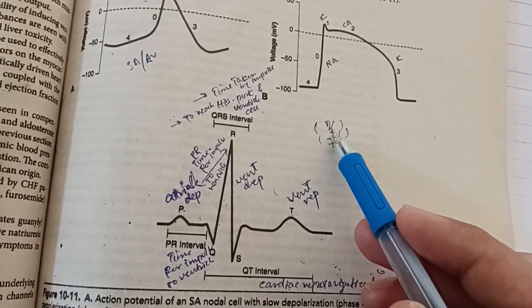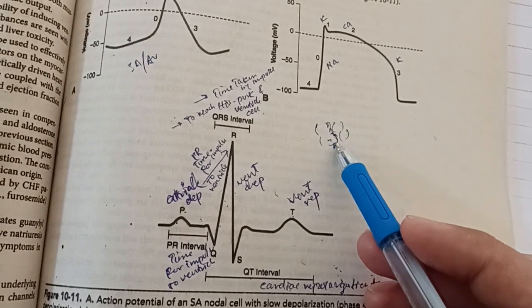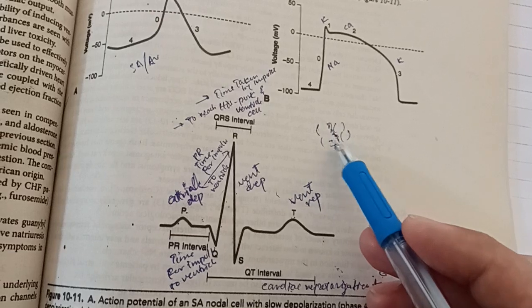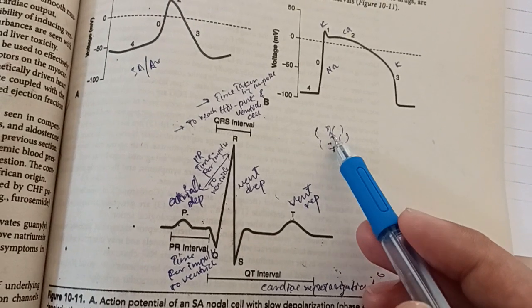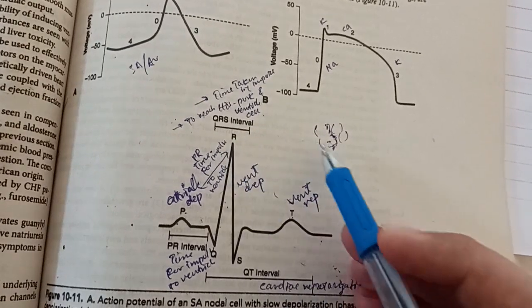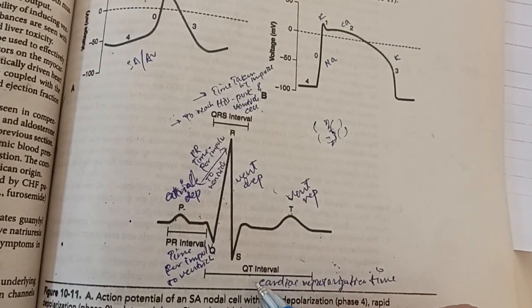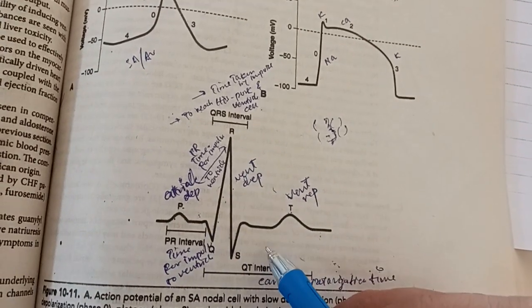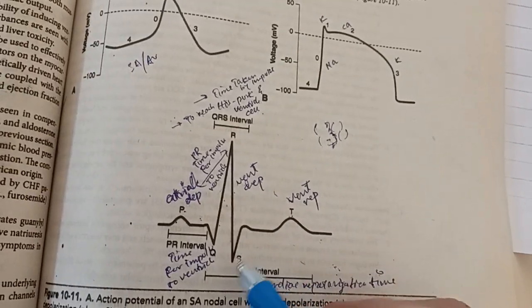The time taken for this is known as the QRS interval. And the time taken for cardiac repolarization is the QT interval. So these are the points about the intervals.